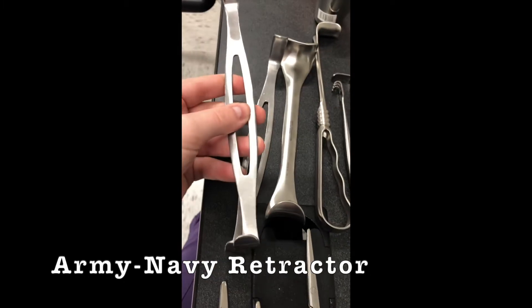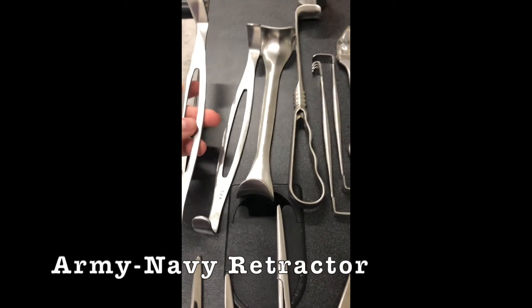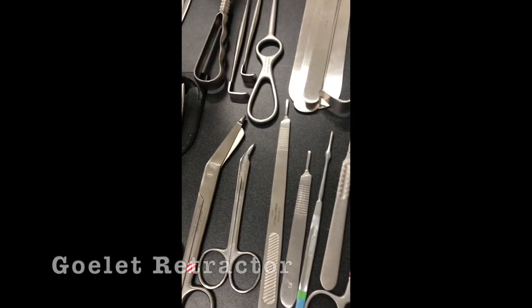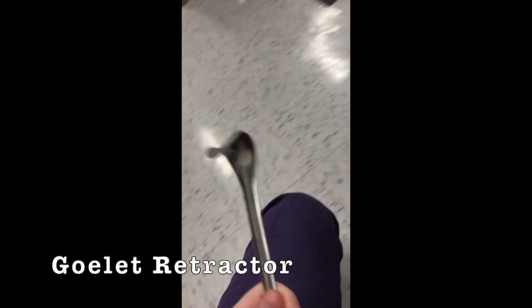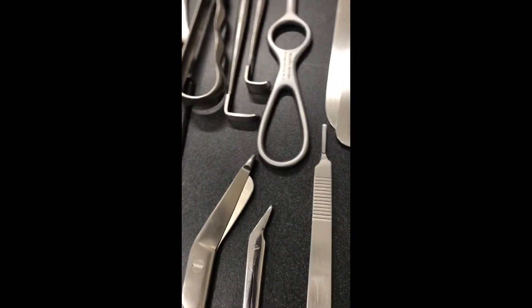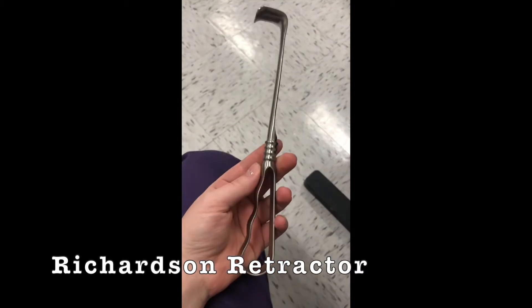We have the USA or Army-Navy, and they come in a set of two. We have the Golet. I always think it's the Ryan Gosling — it starts with a G. The Golet. Okay. And then the Richardson.